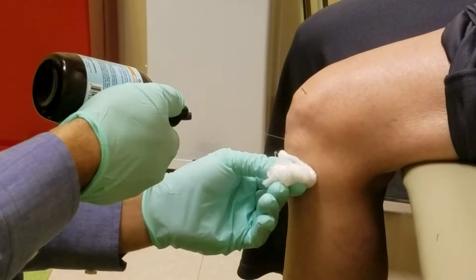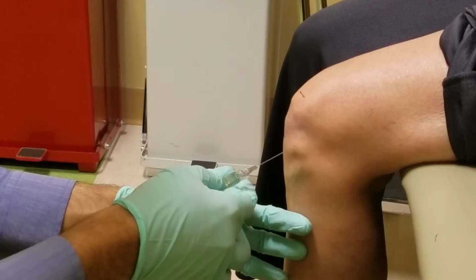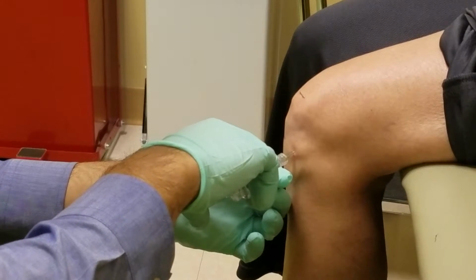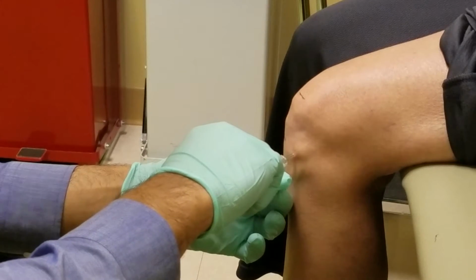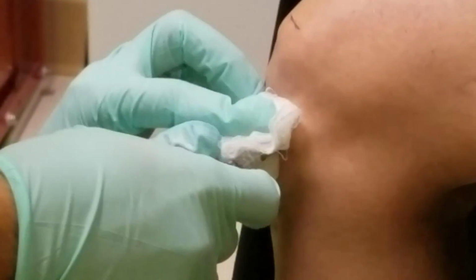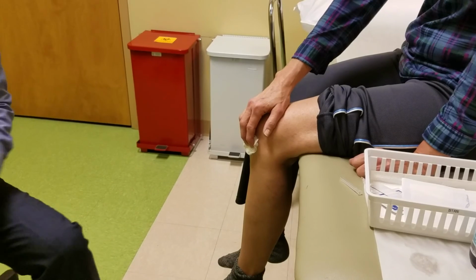And usually with these injections, I use a 22 gauge needle for injection, so their skin got blanched. As soon as that happens, we can take the injection and we'll poke here and right into the notch without hitting any sort of bone. And as long as you have smooth flow, you know you're within the joint. You can also choose to aspirate if you want to make sure you get some fluid return to be completely sure of being in the joint, but usually with a smooth flow it's pretty easy. And then you just place a little bit of pressure and apply a Band-Aid, and that is it.